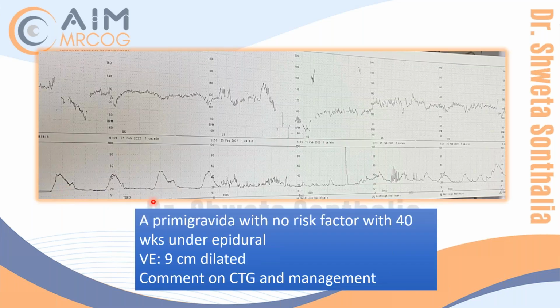Now this is a scenario: a primigravida, no risk factor, 40 weeks, under epidural, vaginal examination 9 centimeters dilated. Comment on the CTG and management. This is also from Saudi Arabia, a picture taken by me. Okay, who wants to describe this?